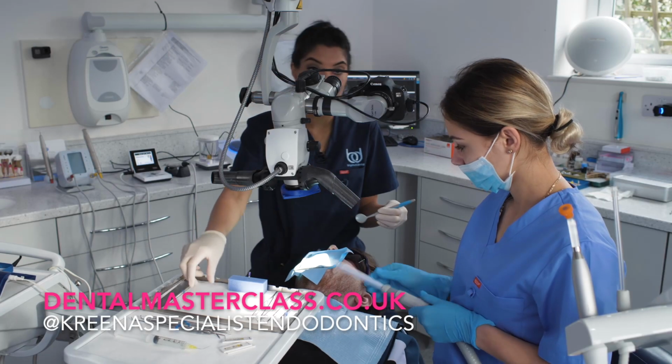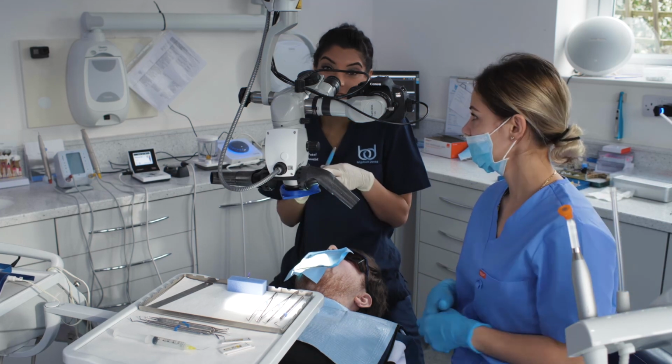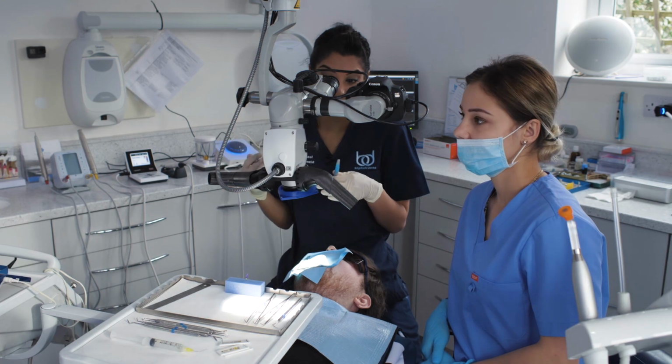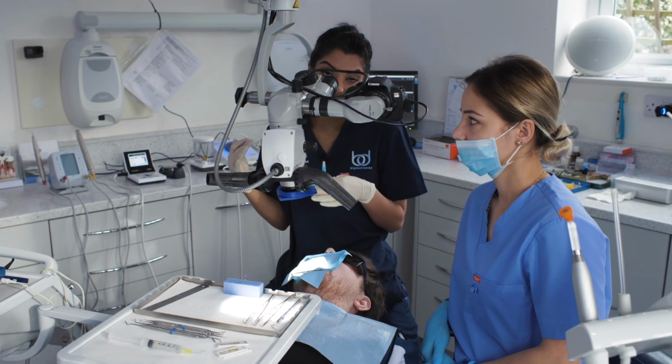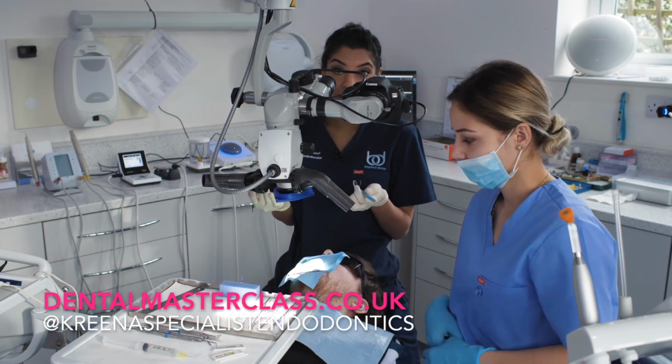I think loupes and a light is something that's really good to invest in. A microscope is obviously amazing because we see about 10 times magnification when you use a microscope, sometimes even up to about 25 times. So a microscope is amazing, but if you have good loupes and light, you can do most root canal treatment with that.